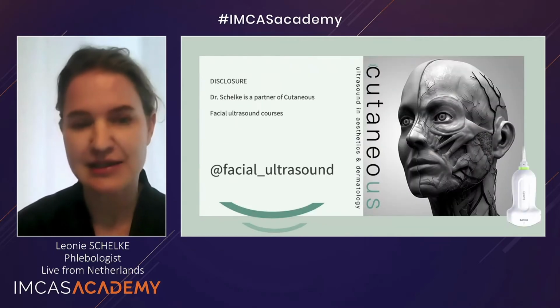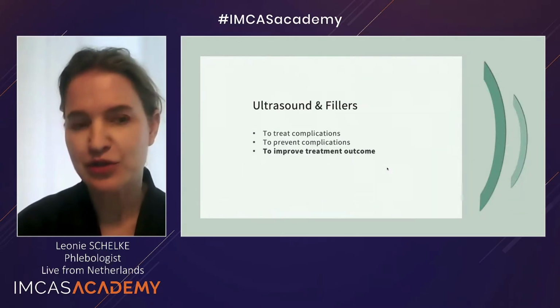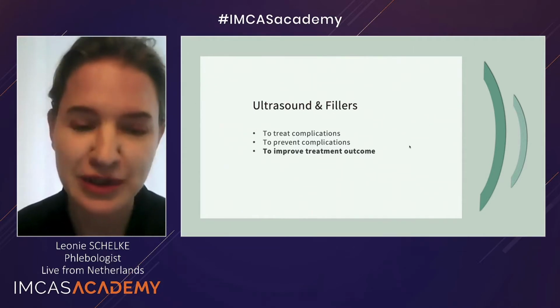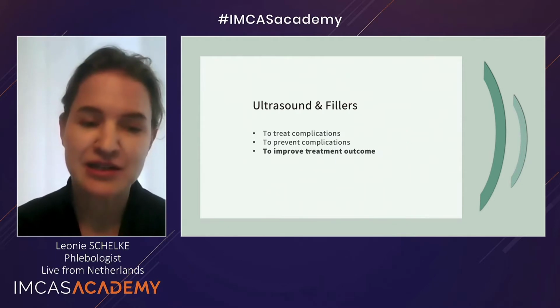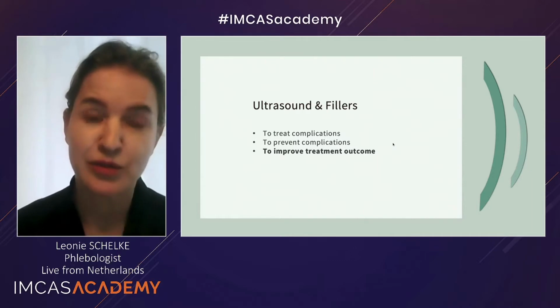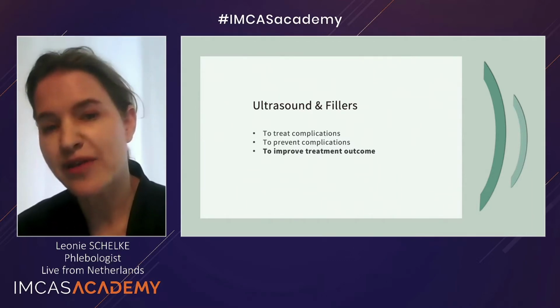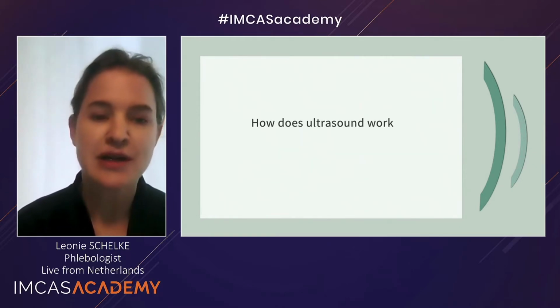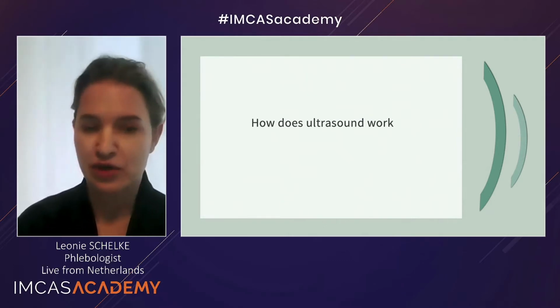This is my disclosure. We have used ultrasound for more than 10 years, and I started using it to treat complications. Then, for the past 7-8 years, we thought: if we treat complications, why not rather prevent them? So I started using it in my daily practice. Along the way, I found out that it was also very useful to improve my treatment outcomes. But let me go one step back, because not everybody works with ultrasound.